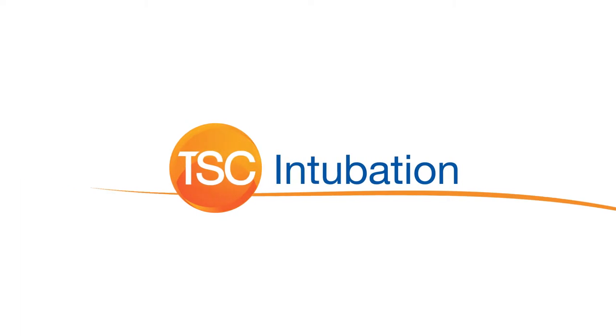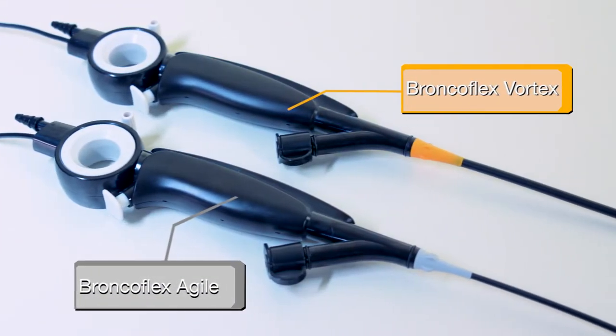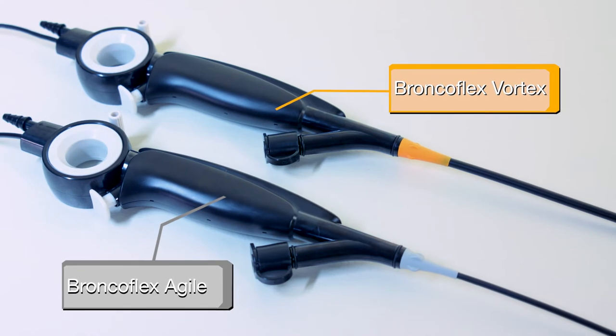The BroncoFlex can be used for intubation. Intubation with a bronchoscope is indicated for difficult airway management or awake intubation. The BroncoFlex is available in two sizes that are color-coded: gray for BroncoFlex Agile and orange for BroncoFlex Vortex.